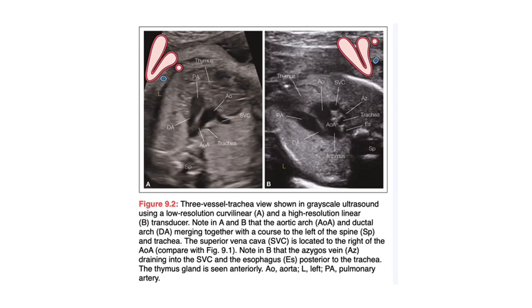You can see that the thymus is a little less echoic than the surrounding lungs. You can see the trachea there. It's not super obvious, but the thing that sets the trachea off is that since the trachea has cartilage rings around it, it'll show with these brighter white echoes surrounding the actual circle, whereas the SVC doesn't have that. So the cartilage rings make it show up a little bit brighter.